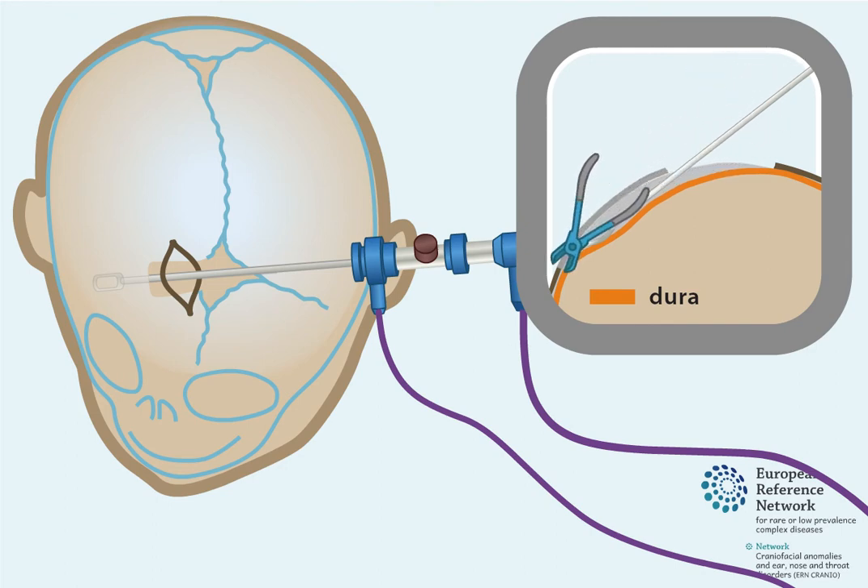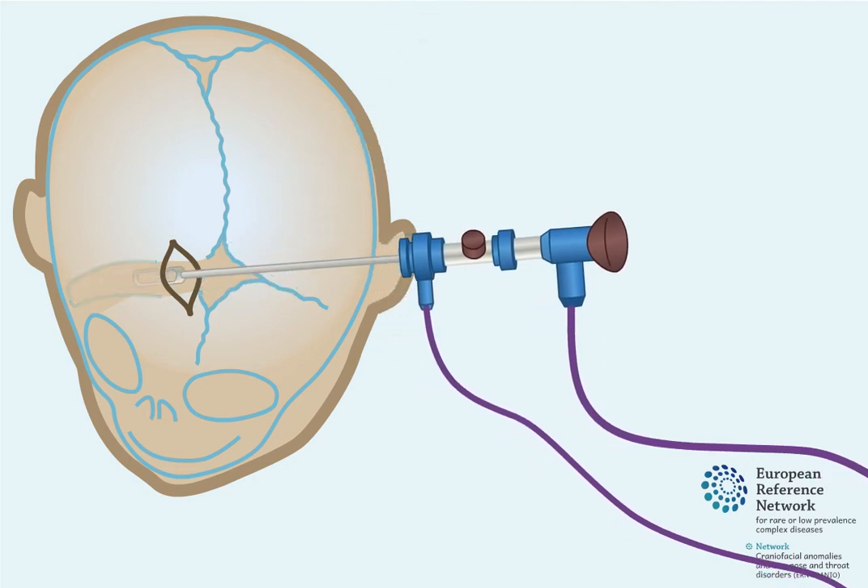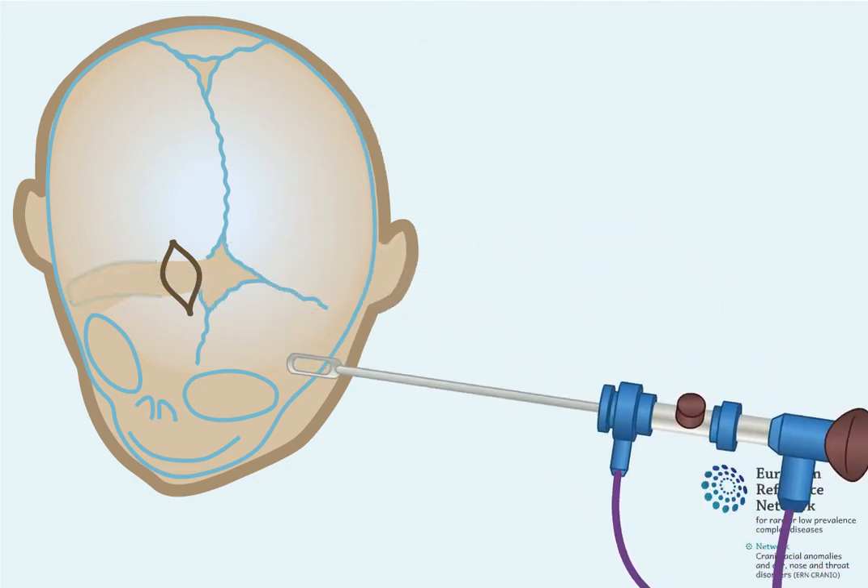Under direct vision of the endoscope camera, a piece of bone at the side of the skull is removed. This opens up the prematurely closed coronal suture, restoring the potential for frontal skull growth on the affected side.